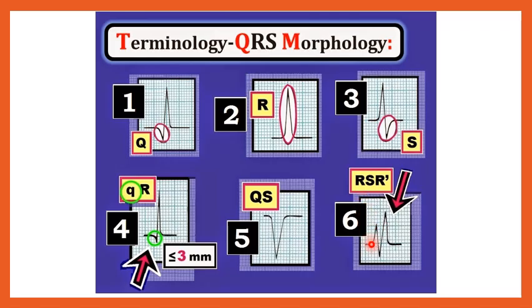You can see the initial upstroke here of the R wave totally eliminates the term Q, right? There is no Q to this QRS complex. There's just an R followed by an S. And look, we even have another terminal R wave here. So we can see that sometimes the QRS complex will contain an additional wave. Sometimes that additional wave might be an upright wave. Sometimes we have an additional S wave.